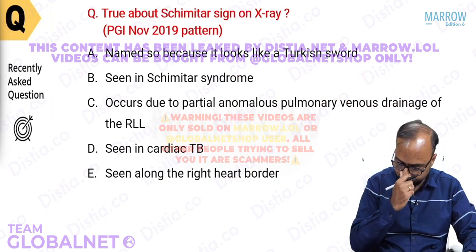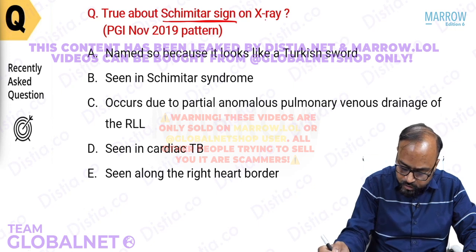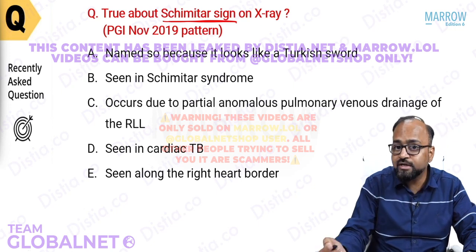Yes. So look at this question. True about the scimitar sign on an X-ray. Is it named so because it looks like a Turkish sword?